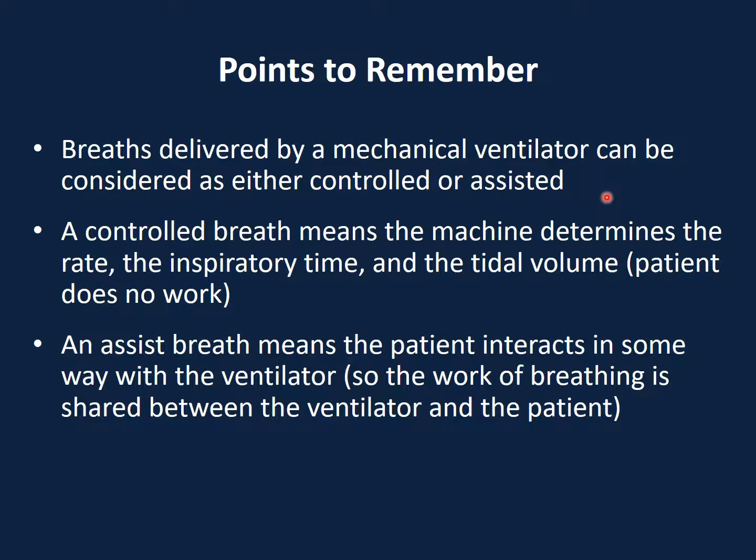So in terms of mechanical ventilator, it can be considered as controlled or assisted. Controlled meaning everything is done by the machine. Assisted means the patient can interact in some way with the ventilator, and most of the time it's about triggering the machine and therefore the breath is being delivered.